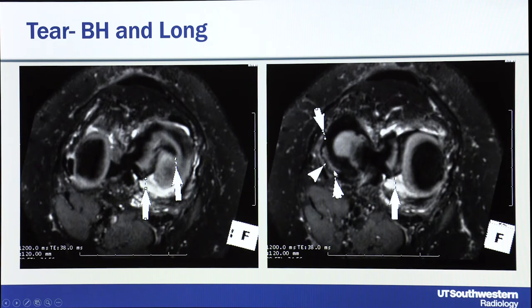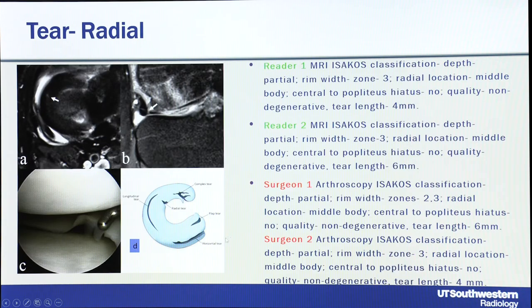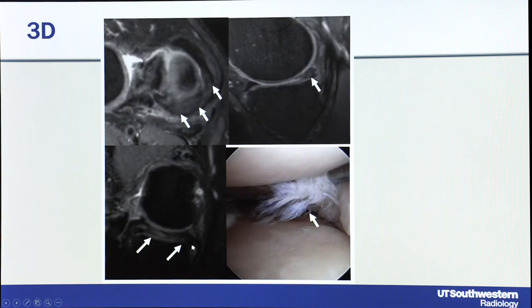Radial tears are quite small — you can see this tiny tear, visible along the radius of the meniscus on arthroscopy. Horizontal tears show fraying of the edges with a small flap component. On axial images they appear as blurring of the edges, an expanded meniscus with myxoid degeneration and fraying of the margins — consistent with their appearance on arthroscopy.